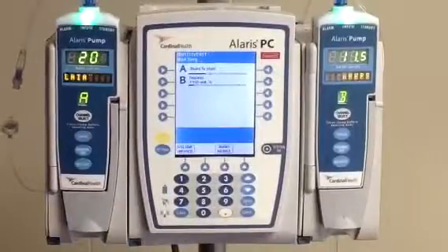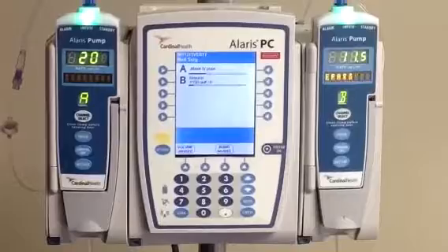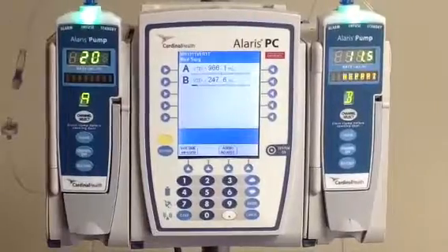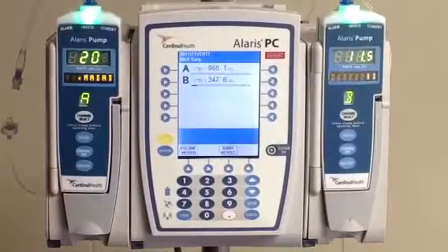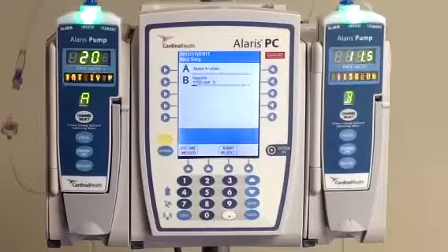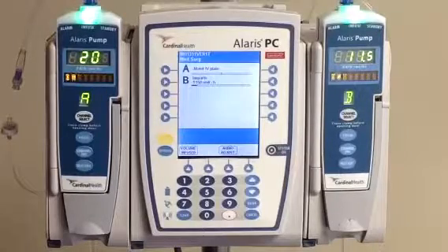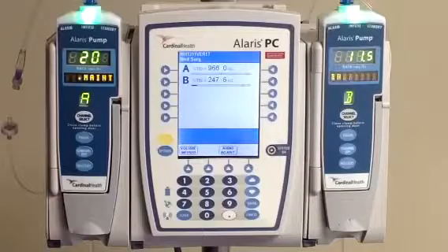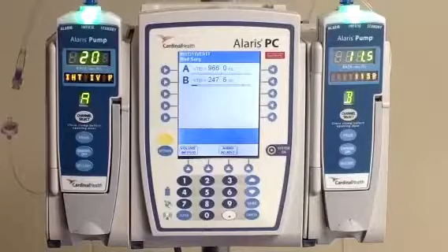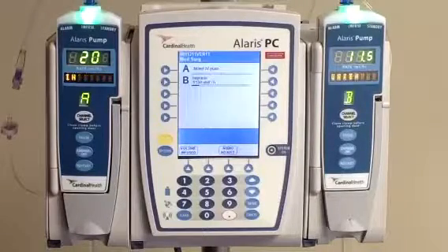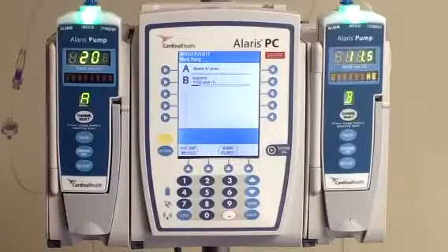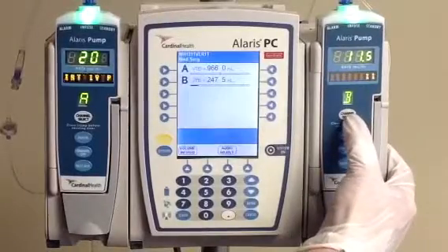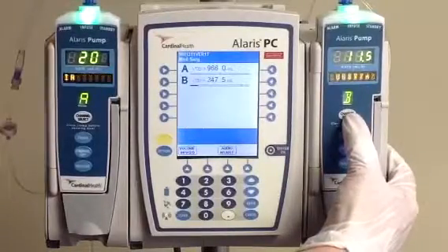Once the bolus is complete, you'll notice that we've changed back over to our rate of 11.5. Fast forwarding six hours in our scenario, the result is back for our heparin level and it is now 1.04. Based on our order, that means we're going to have to change our rate down another 100 units, and we're going to hold our infusion for 30 minutes.